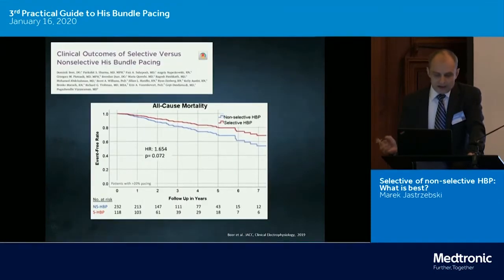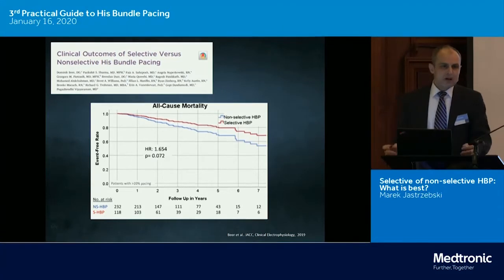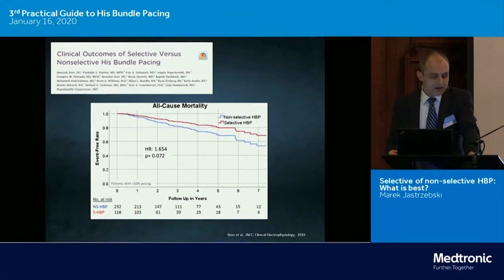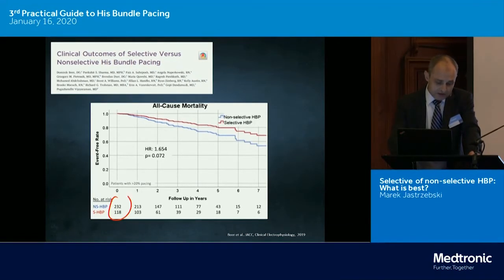What about the clinical data? Because the ultra-high frequency method is not well established and doesn't have clear correlation with clinical outcomes. The best clinical data that we have comes from the study by Bear and Pugal. And what we see here is the official conclusion of that study, based on, as you see, several hundred patients, is that there is no difference.